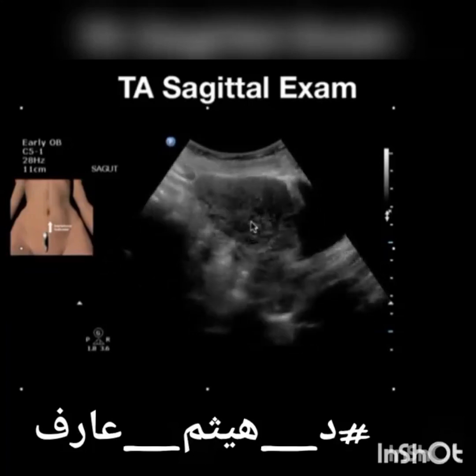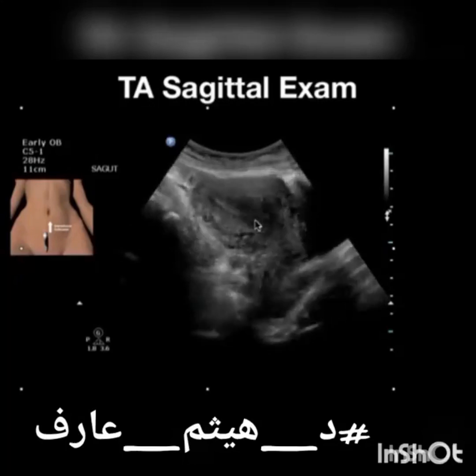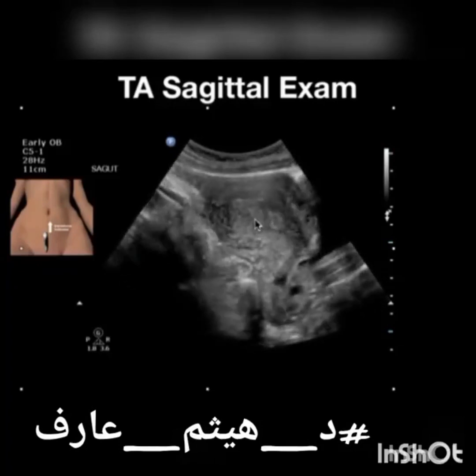So you can see we're sweeping from one side of the uterus to the other. And again, you can see here that the uterus is anteverted. You've got urinary bladder. Here's vaginal stripe. These are Nabothian cysts here. This is going to be the cul-de-sac here. You can see bowel adjacent to the uterus here, but if there was free fluid, you would see it here. You can see the myometrium here, and you can see the hyperechoic endometrium.